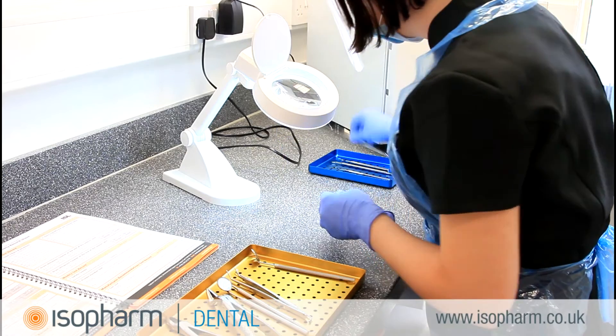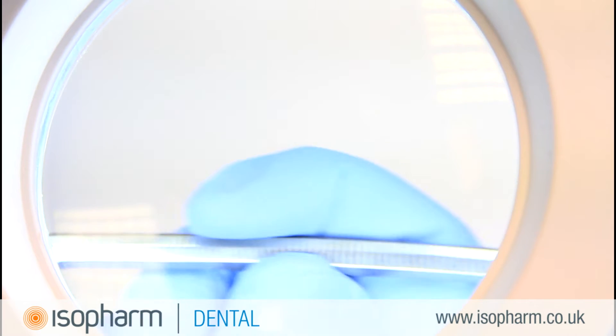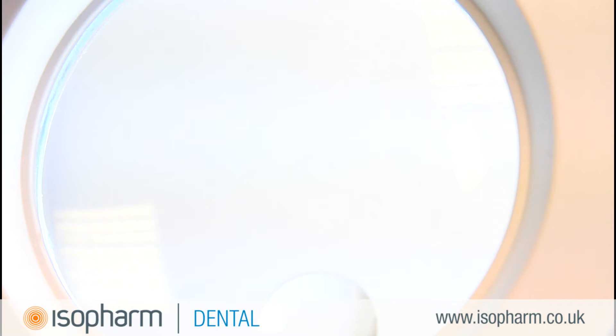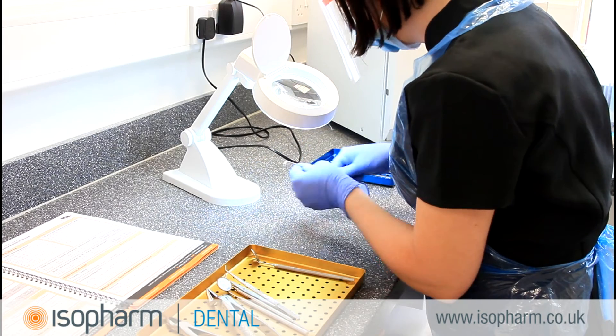A visual inspection is required before sterilisation to make sure that the cleaning process is removing staining and debris. If an instrument is not properly cleaned it may impede the sterilisation process. The cleaning of instruments is an important part of the decontamination cycle, and if this is not done correctly then the rest of the process will fail.